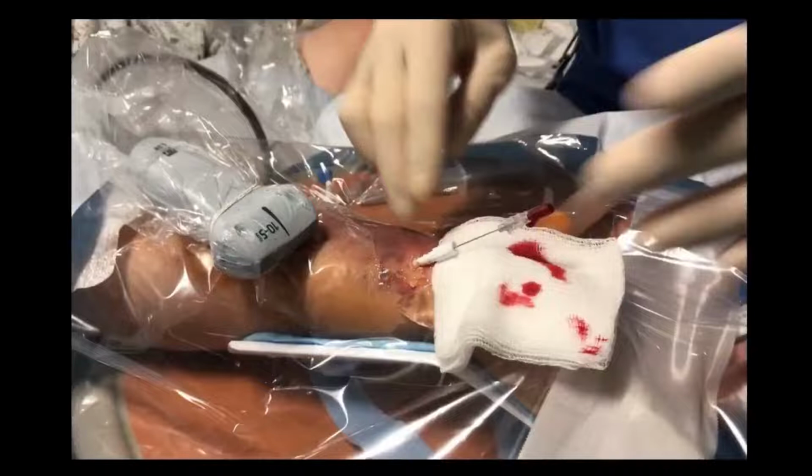So very slow. This patient had a prior access, and that's why the bruising in the hand, that's not our doing. Some clinical cases, a lot of images and clips.